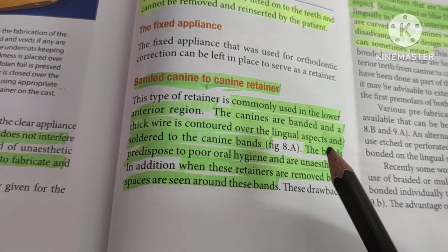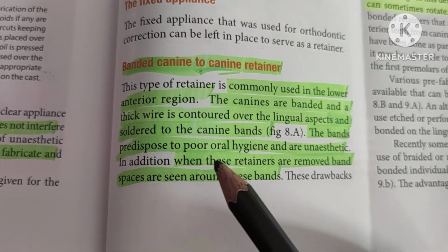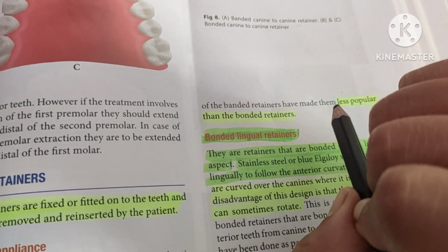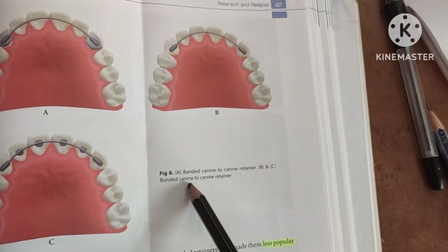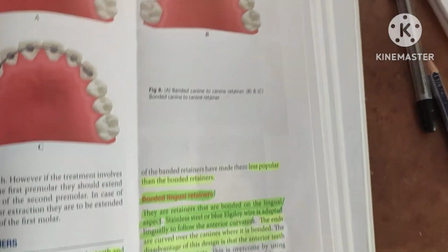It is soldered. Now, the bands predispose to poor oral hygiene and are unaesthetic. In addition, when these retainers are removed, band spaces are seen around the bands. And because of this disadvantage, it is less popular than the bonded retainer. The next is the bonded canine to canine retainers. Here bonding is done, canine to canine.